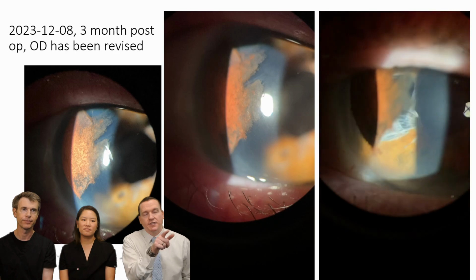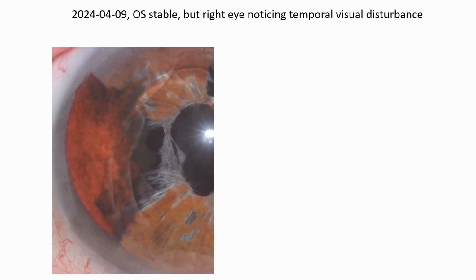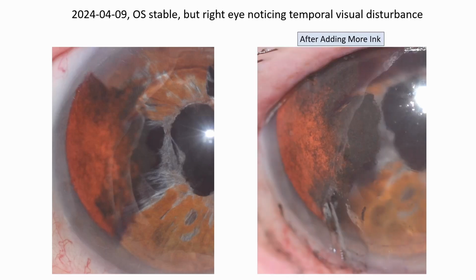This is 3 months out, still stable, but at this point a little bit more ink was added, a little revision to that area to try to block a little bit more. And then the patient later came back again, still noticing a little temporal visual disturbance, and I tried to outline for you where even a little more ink was added. At this point, it resolved most of their symptoms, I believe, in this case. Again, another way to improve things.